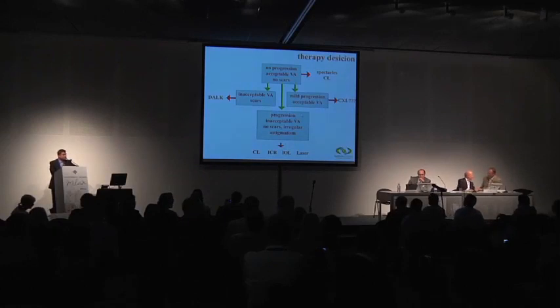However, if we have progression, unacceptable visual acuity, no scarring in the central cornea, and irregular astigmatism, contact lenses, intracorneal rings, intraocular lenses, phakic intraocular lenses, or topo-guided laser ablations, alone or in combination, are good options, not only to perform the corneoplastic effect in this very diseased cornea, but we can also try to treat the refractive component that, as we know, is important in patients with keratoconus.